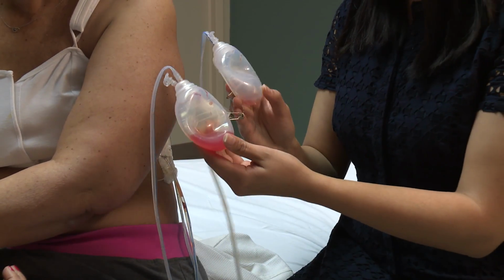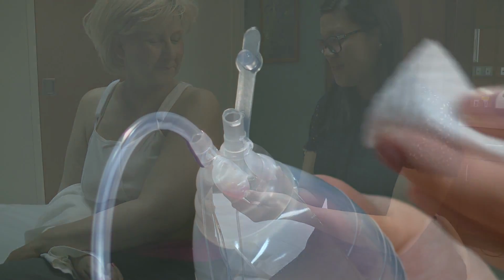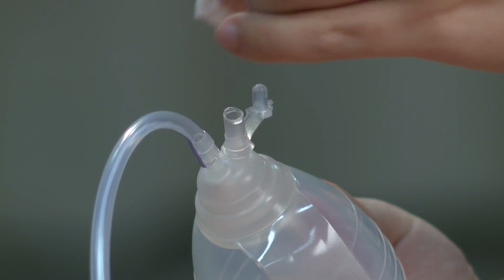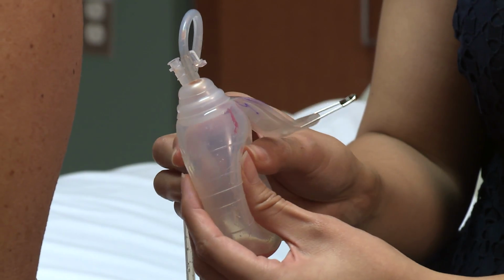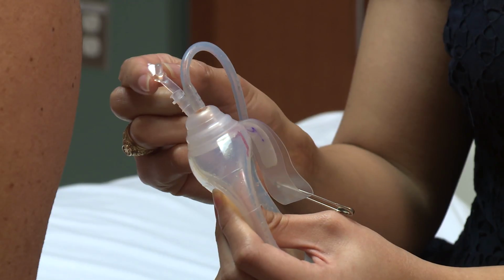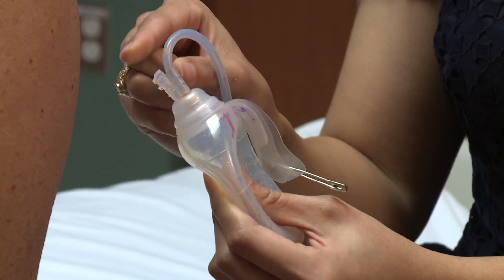After emptying and measuring the fluid from each bulb, you will need to reactivate the bulb suction. First, wipe the port opening with an alcohol swab to clean it. Next, gently squeeze the bulb and flatten it as completely as possible. While the bulb is completely flattened, insert the stopper into the emptying port as far as possible.